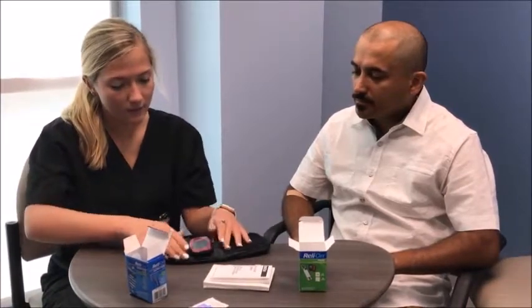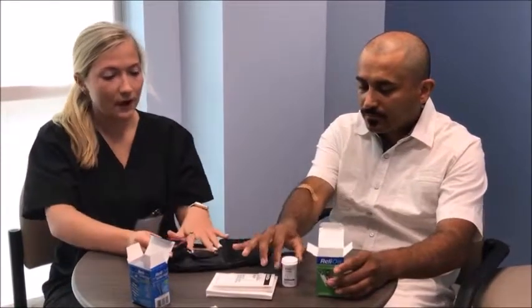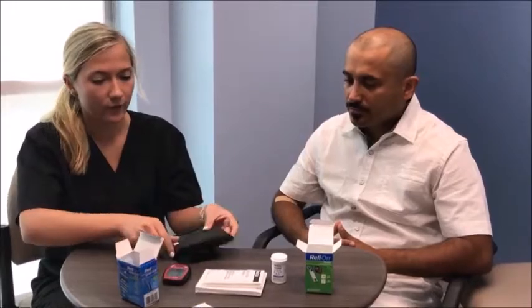As far as the monitor, it has a little carrying case, and I would very much recommend that you take it wherever you go in case you need to check your blood sugar. Okay, so let's go ahead and start going through how to take the reading.